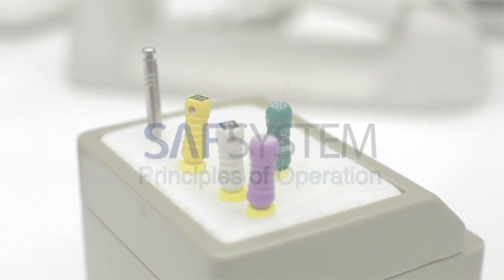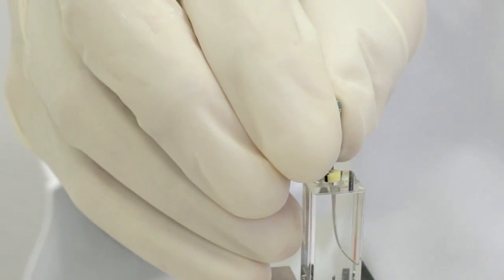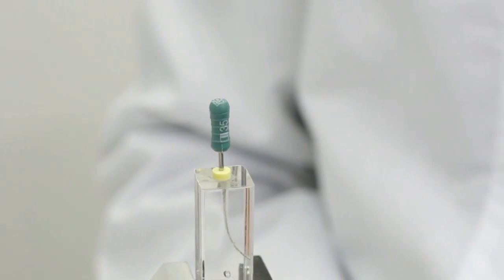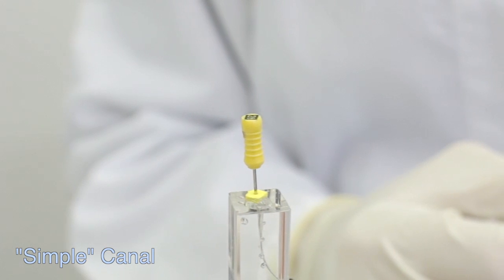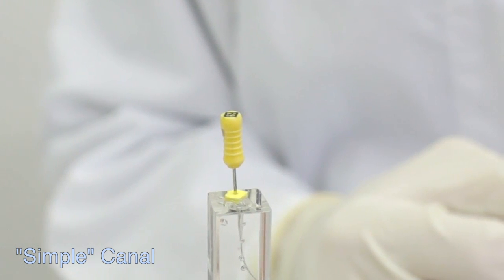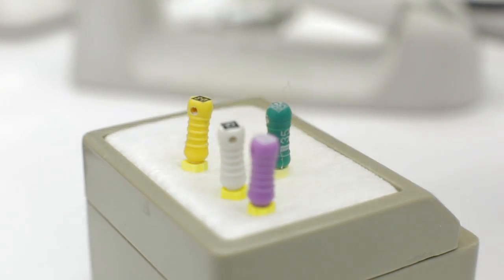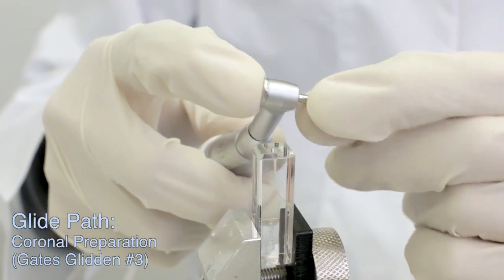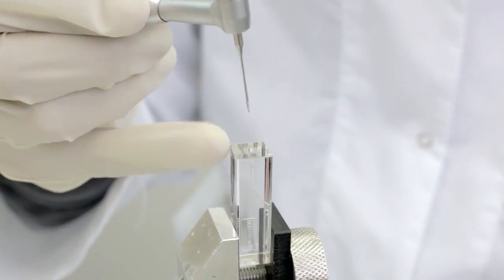To classify the case, we need to check for the first instrument to bind at working length. SAF 2 mm should be used to treat wide canals presenting apical size 35 or larger. SAF 1.5 mm can be used with no additional glide path in simple canals presenting apical size of 20. Canals that only allow a number 15 or 10 file to be inserted to working length will be classified as medium complex and complex canals respectively. In these cases, a glide path must be created that will allow the free insertion of the SAF to working length.